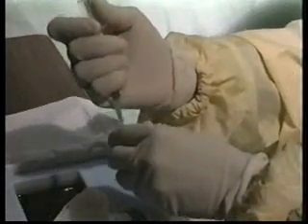Keep the patient informed. Keep in mind that your back will be a sterile area, so try not to touch it, okay? When cleansing, always start in the center of the field and work outward in a circular pattern. Repeat this for a total of 3 passes. If you run out of applicators, use gauze.